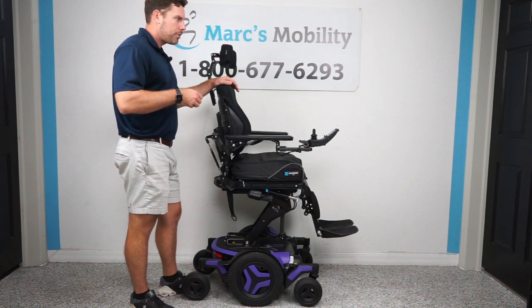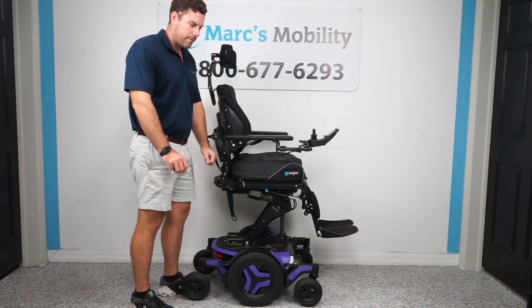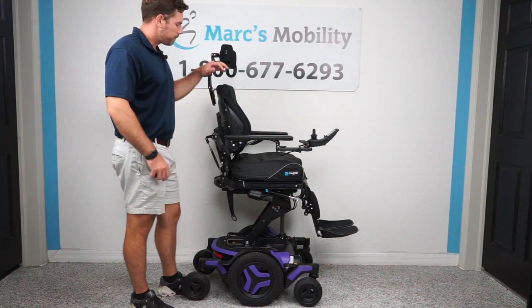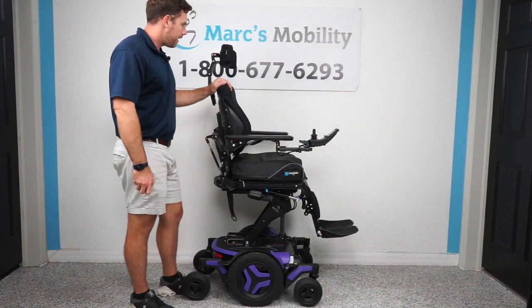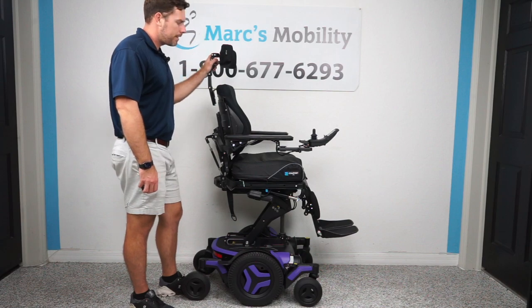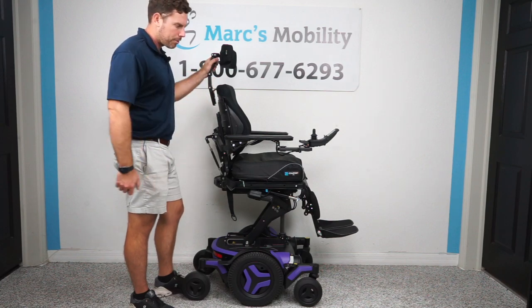Having the height elevation helps you reach things and makes it more accessible. Sometimes it helps people get out of the chair because they can stand up, lock their legs, and pivot out. If you do transfers into a vehicle or into a bed with a slide board, it's nice to have that ability to adjust height. If you're crossing roads or driving outside, it makes you a lot more visible when you're up high than when you're down low.